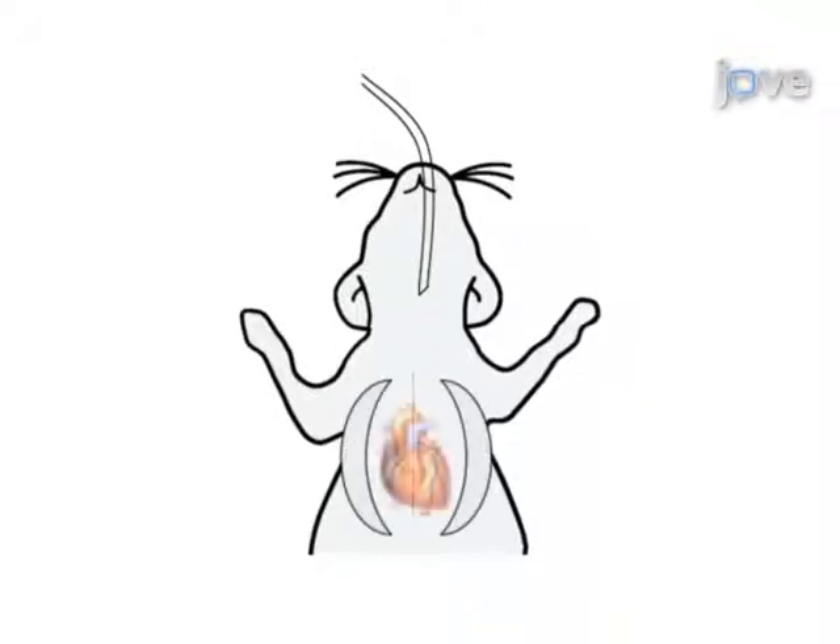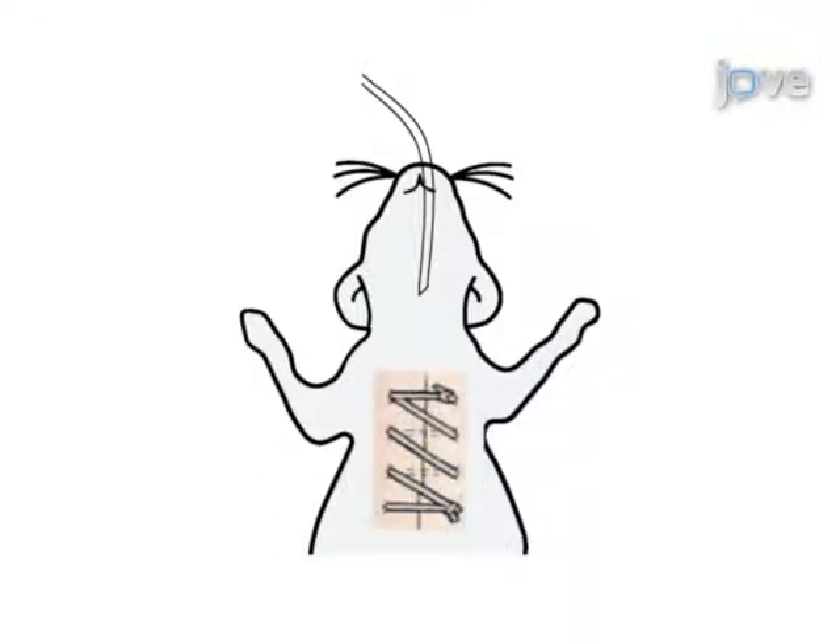Next, a partial thoracotomy to the second rib is performed and the sternum retracted. The transverse aorta is identified and subsequently ligated between the innominate and left carotid arteries. The ribcage is closed, followed by the skin with a continuous suture pattern.